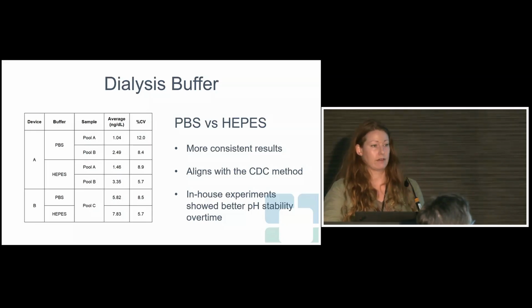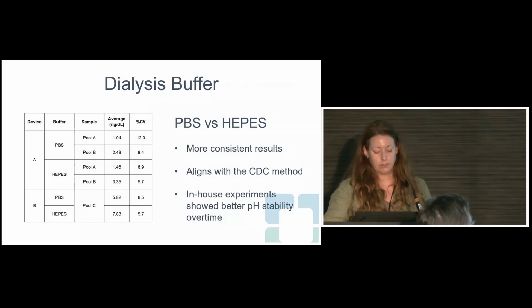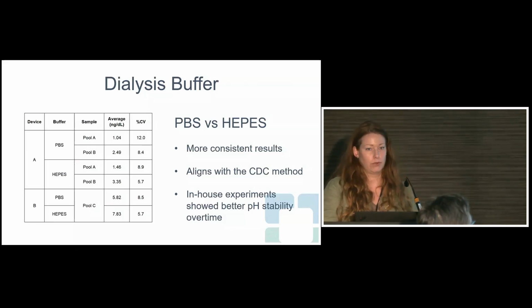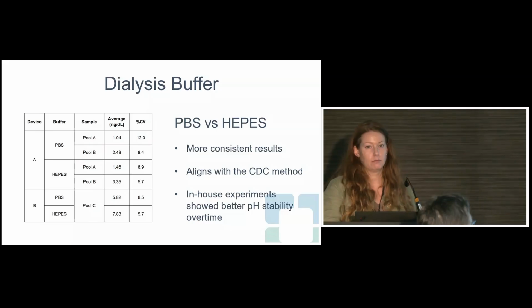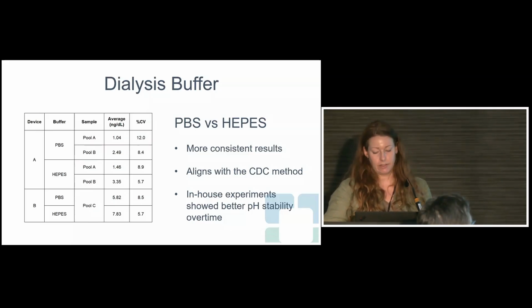So the lab will only have to pH up front once a week, and then we can store that into single aliquot containers that can be pulled the day of dialysis, and that also helps with contamination because you're not using the same product over and over again. You're not pulling it out of the fridge, putting it back, and things like that.